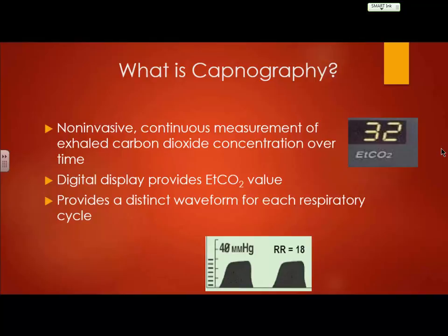So why does this provide us a little more information than just SpO2? Okay, yes, and so that is one of the things. It does give you a real-time view of what's happening with the metabolic processes of the body, referring to perfusion. Also, SpO2, it just tells me what?